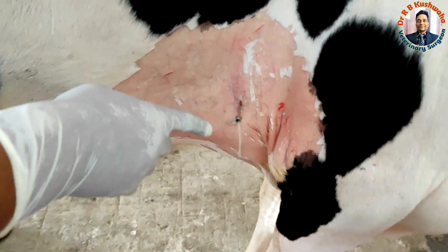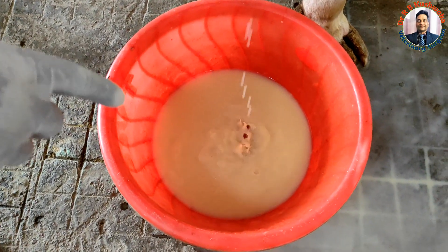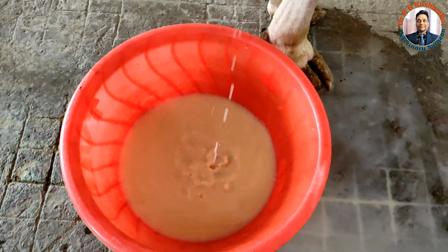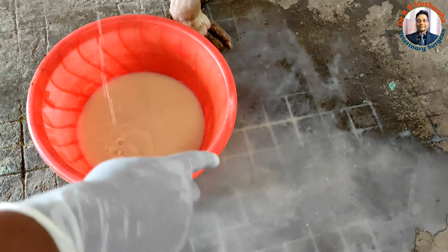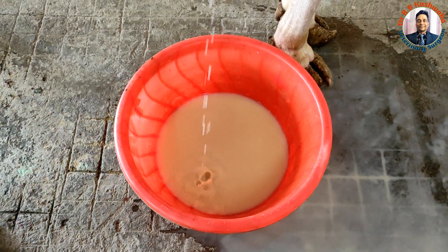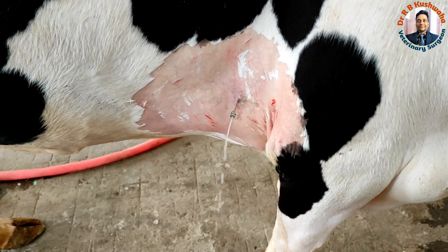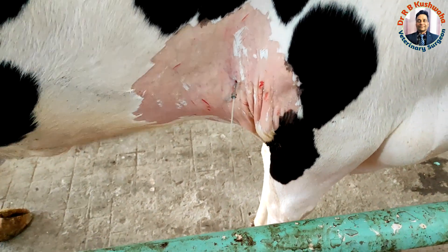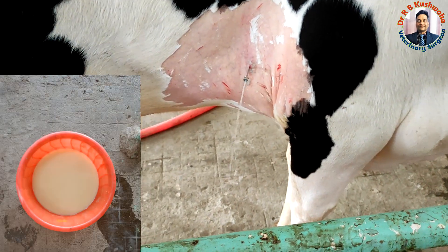Now you can see the fluid drainage is still coming — the pericardial fluid is still coming. This is around one litre in this container, and even before that, already half a litre of fluid was spread on the ground. So overall, about 1.5 litres have already been drained and it is still coming with force. Hopefully in this case, the ultrasonography also showed a lot of fluid around the heart — let's see how much is coming.